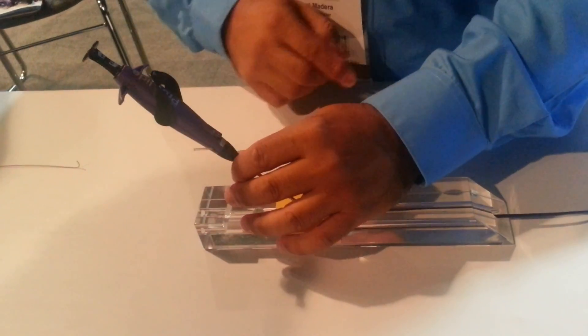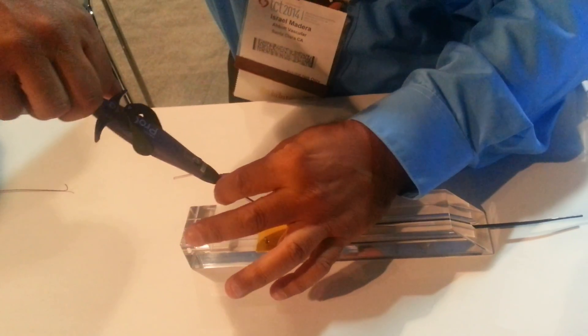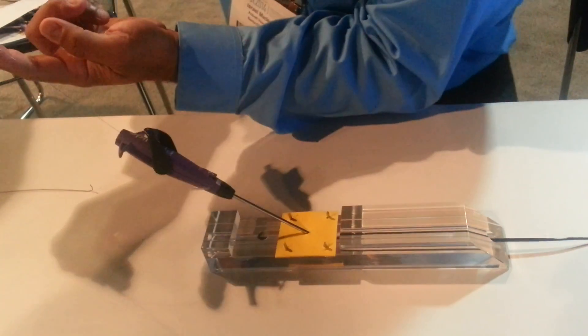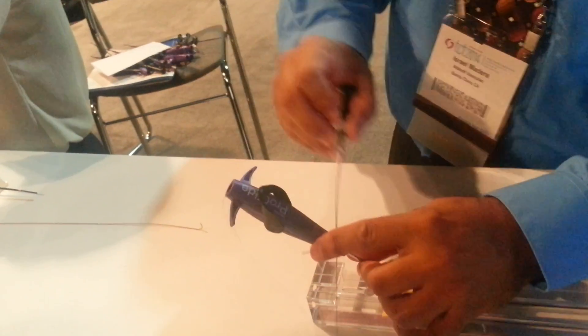So once you have that — needles are in, we've confirmed everything. Same thing, we're going to remove it. I have a good connection. I see the link and I see the suture.